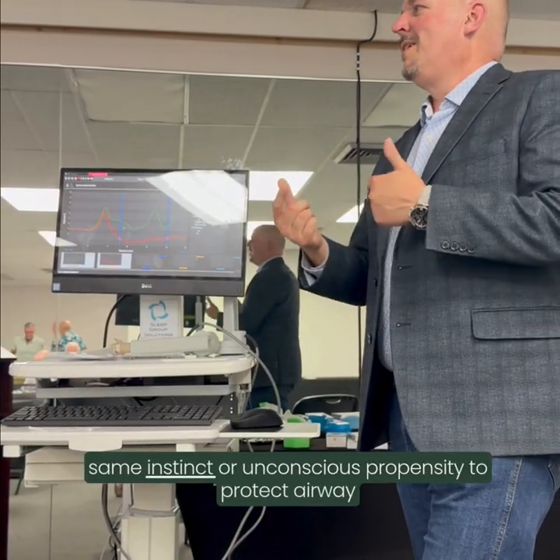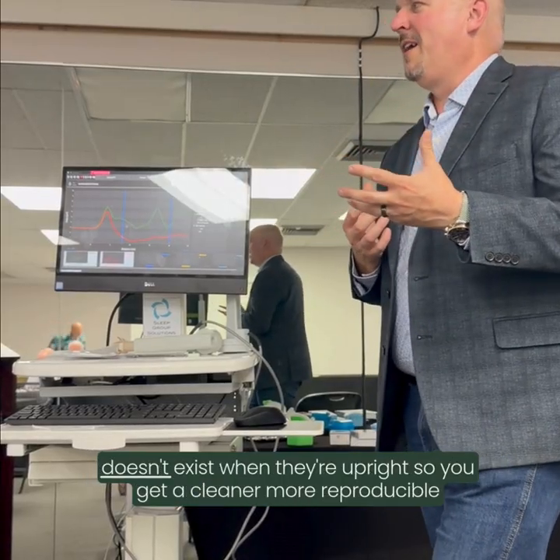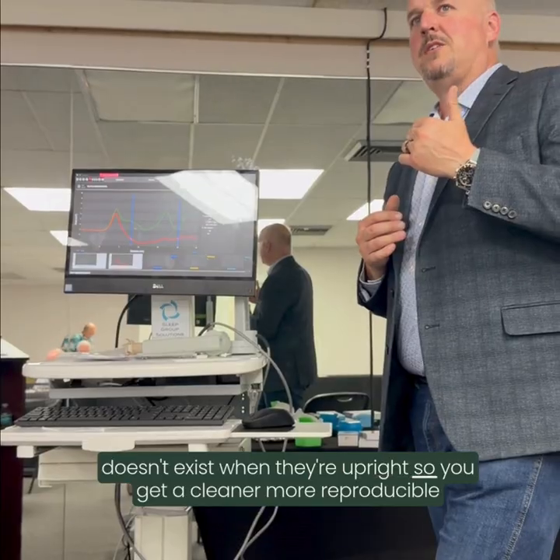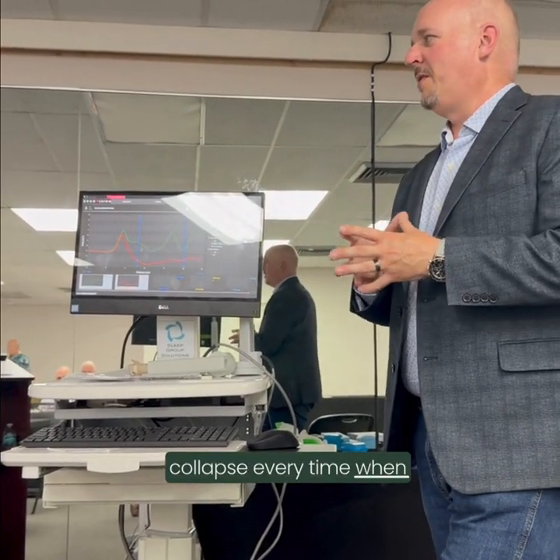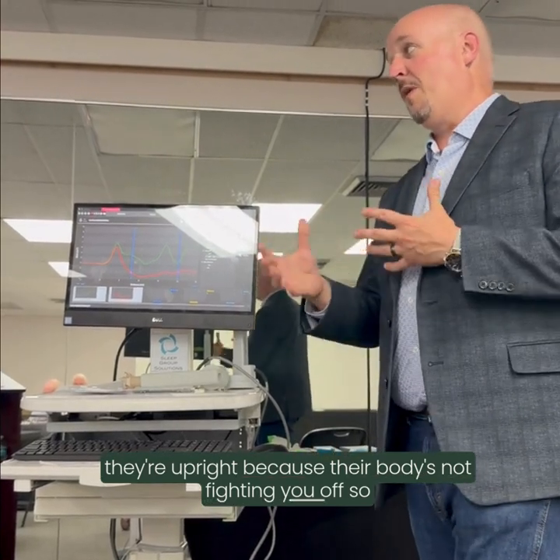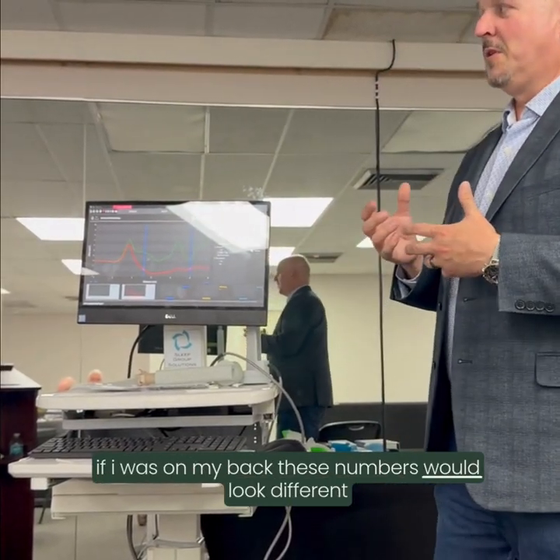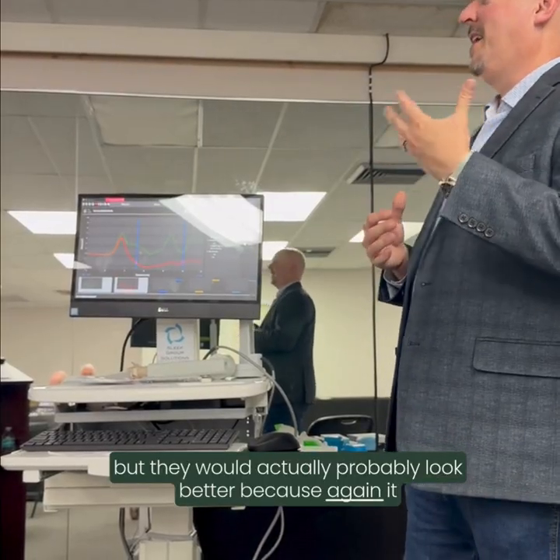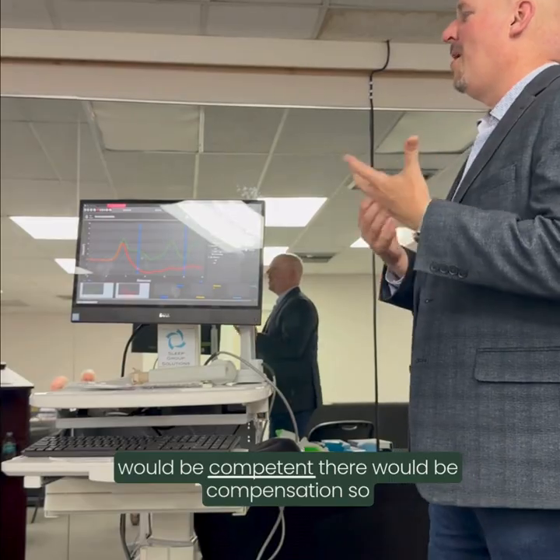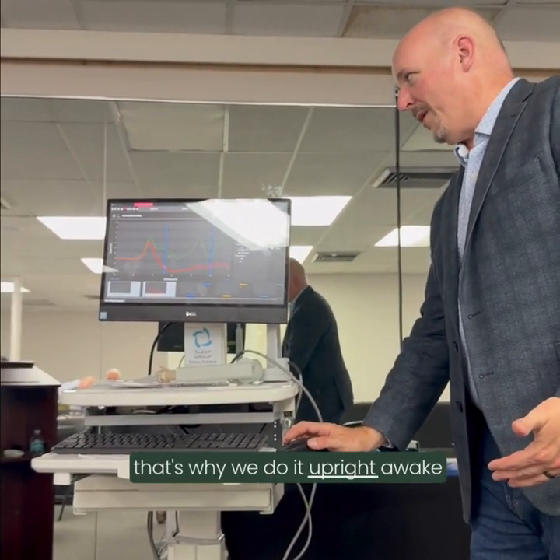That same instinct or unconscious propensity to protect the airway doesn't exist when they're upright. So you get a cleaner, more reproducible collapse every time when they're upright because their body's not fighting you off. So if I was on my back, these numbers would look different, but they would actually probably look better because, again, there would be compensation. So that's why we do it upright.